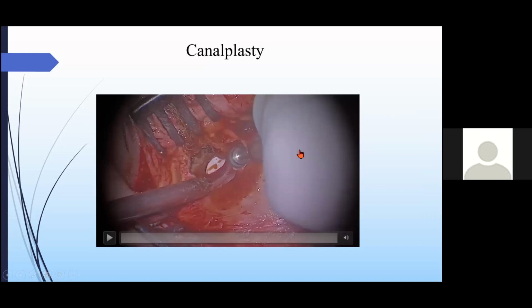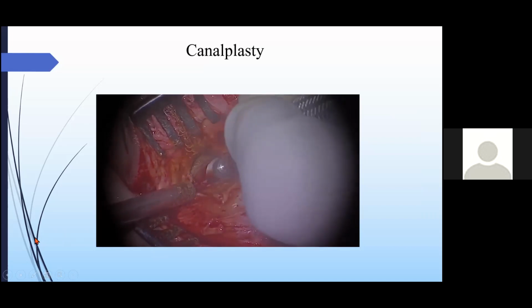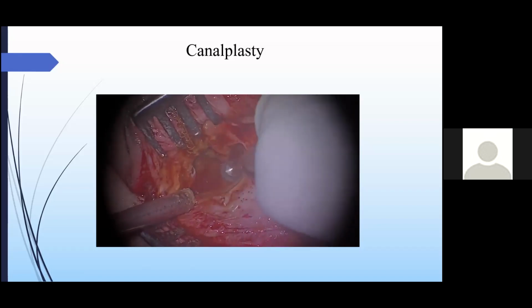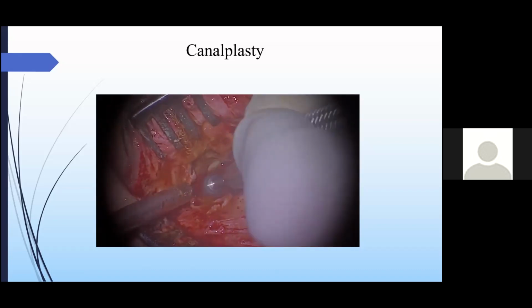So this is the left ear of the patient. We are going to perform a canaloplasty, and we are going to start from the posterior canal. A large cutting burr, 6 or 7 mm, is taken with an appropriate copious suction irrigation system, and drilling is started in a parallel fashion. Let's see that. You can see drilling is continuously done in a parallel fashion with continuous irrigation along the annulus. You can see along the direction of the annulus, or in a superior or inferior direction.